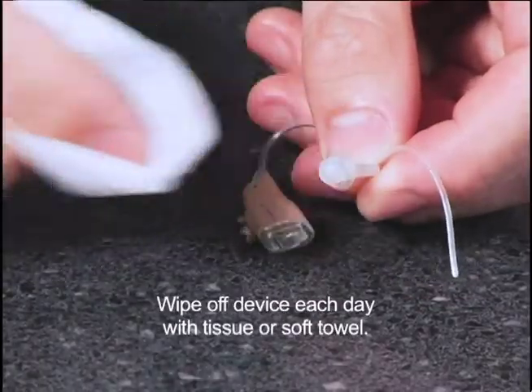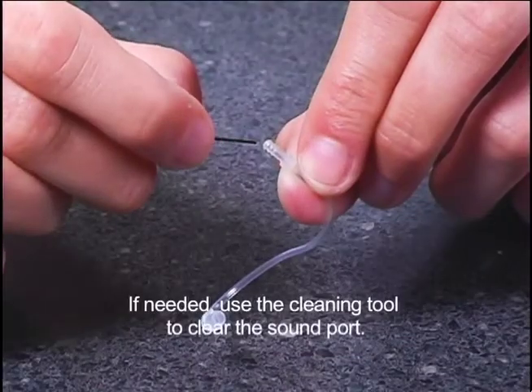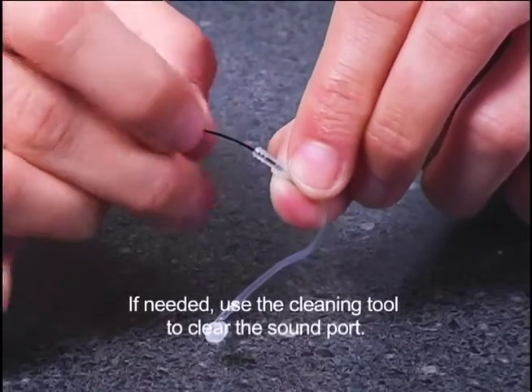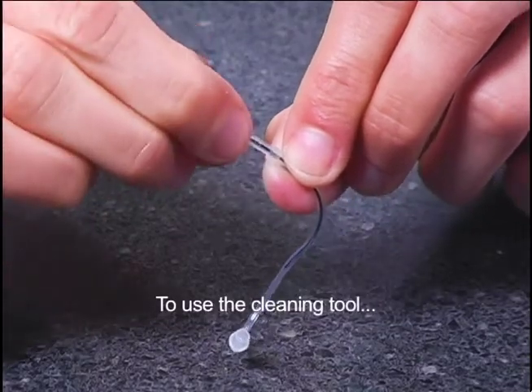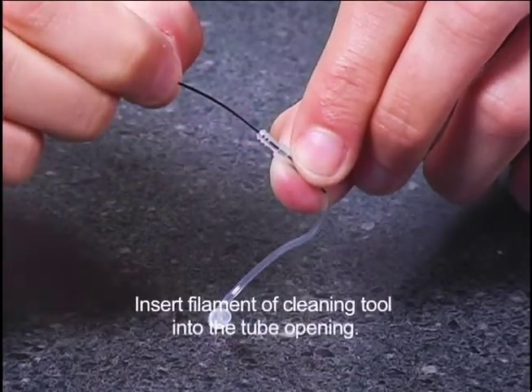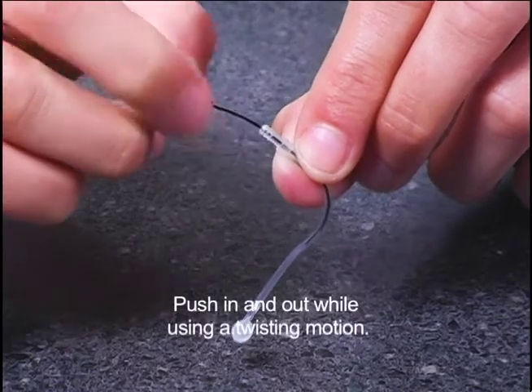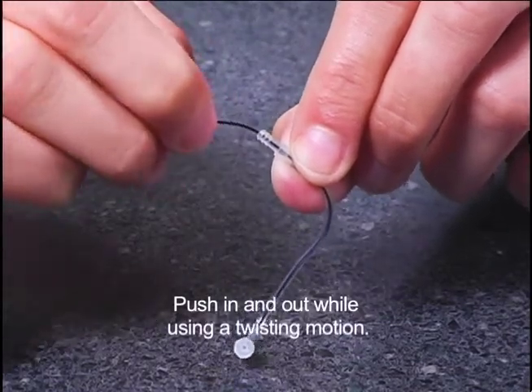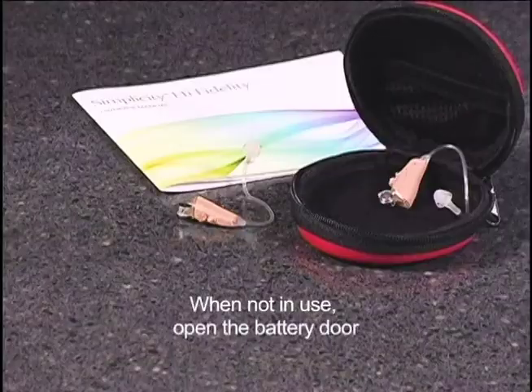Each evening, wipe the device clean with a soft tissue or small towel. If needed, use the cleaning tool to clear the sound port of any blockage. To use the cleaning tool, slowly insert the filament end of the tool into the sound port of the sound port dome. Push in and out while using a slight twisting motion several times.